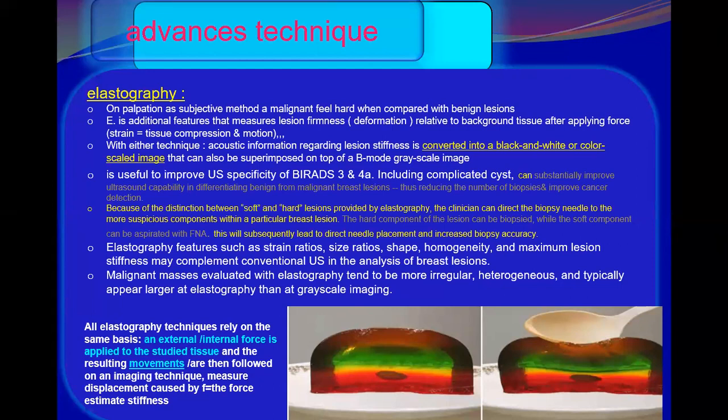You see, if the lesion is suspicious, regardless of elastography, it has to be biopsied. If it is a simple cyst, there is no need to do elastography. It is typically benign.